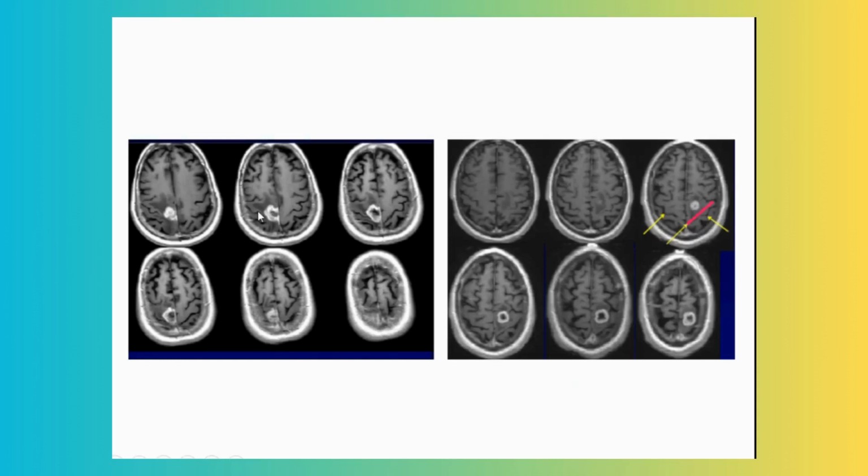So here, this is the central sulcus. You can see the hand knob of the other side. Here the anatomy is distorted due to tumor mass effect, but you can see that this is the central sulcus coming in. This is the pars marginalis. So this is involving the foot motor area.